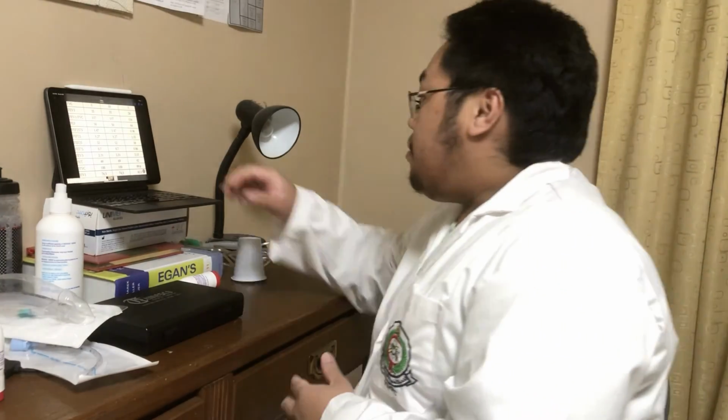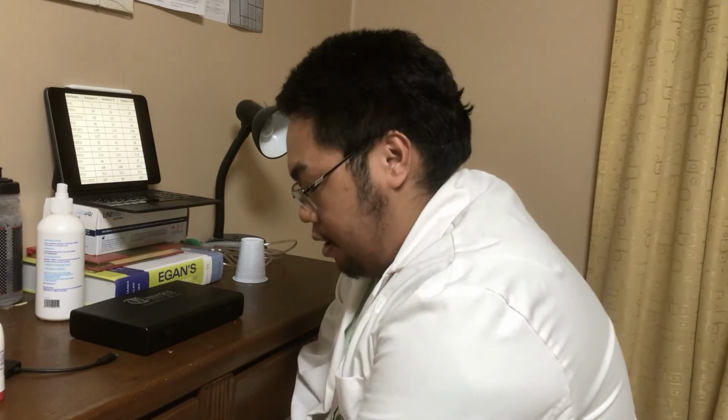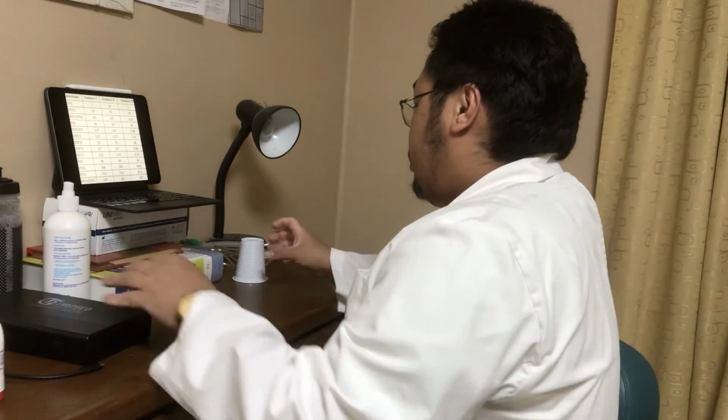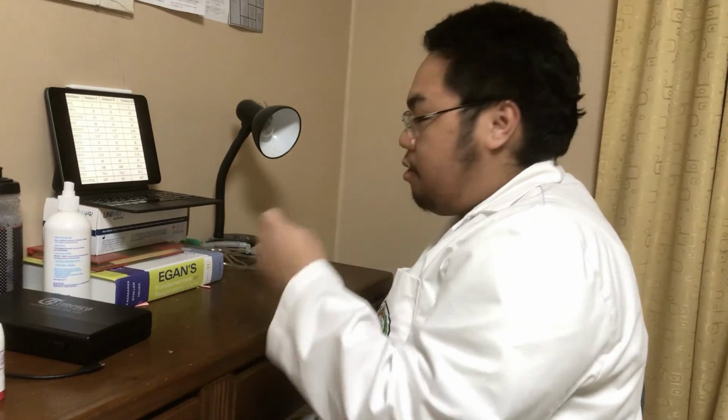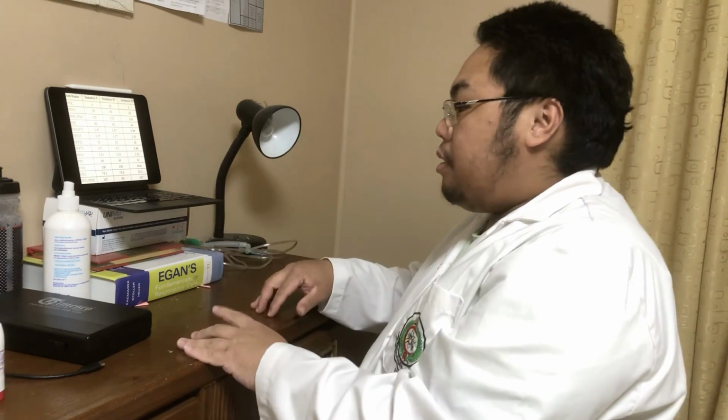After the patient leaves, make sure to do aftercare. Cleaning up after your things is important in order to sanitize and avoid any contamination of the area. And the mouthpiece is disposable, so you have to throw it. And then after doing aftercare, make sure to input pertinent data. Inputting the pertinent data helps for a more progressive idea of the patient next time he comes for a test. Thank you very much, and that's the RD for our spirometer pulmonary function test.